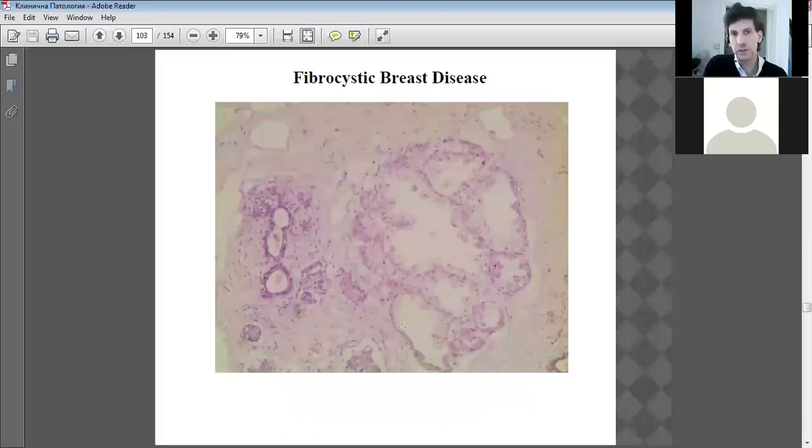This has very extensive disease, huge lumens, very large lumens all over, nests, lots of hyalinized tissue, huge mass. The rest of the breast tissue has been disrupted in terms of its function, it's been replaced by hyaline. However, I cannot see examples of necrosis. Okay.